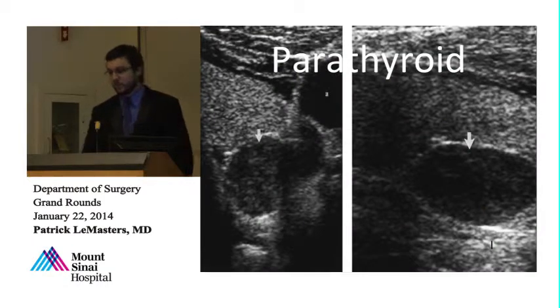So continuing on, I just wanted to briefly go over the parathyroid, which we do. I think this is integral to our training. I just had a case with Dr. Aurora 2 weeks ago at Elmhurst where we were performing a total parathyroidectomy in a patient with secondary hyperparathyroidism, where we brought the patient to the operating room and scanned the neck in the operating room. We were able to identify all 4 glands. Then we were able to enter the neck with the game plan. We knew where we were going, we knew what we were going to find, and it was an integral part of the operation.